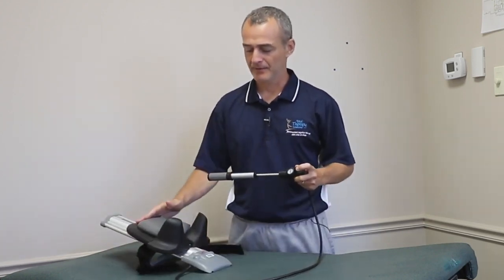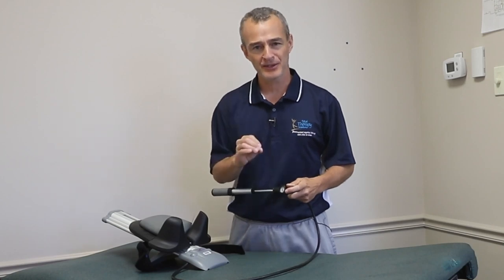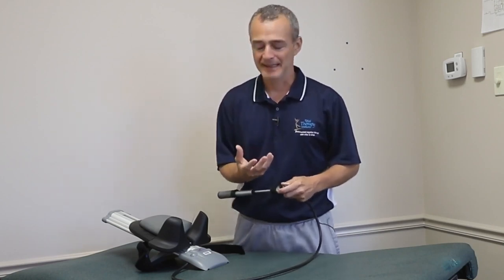If you follow the standard recommendation, you can pump this up to a certain amount of pressure. But what I typically find works best for most of my clients, and truly what works best for me, what feels the most comfortable to me, clinically, if a patient is experiencing pain, soreness, discomfort, the way our bodies react to that pain is by tightening, by guarding. And when you think of the musculature that crosses the neck, it goes from the top of the shoulders and the rib cage up into the base of the skull, into the vertebral bodies, the bones in the neck. When those muscles are tight, they're going to pull down on the head and they're going to pull up on the body, right? So if my head normally weighs 12 to 15 pounds, when those muscles are pulling tight, it's like wearing a 40-pound helmet. You can imagine how it's going to compress down.